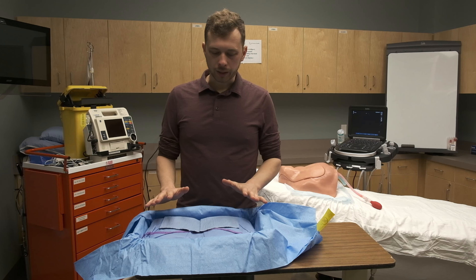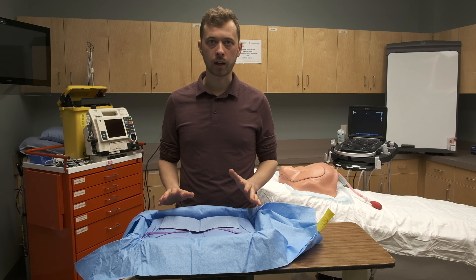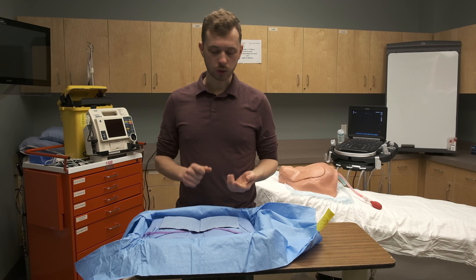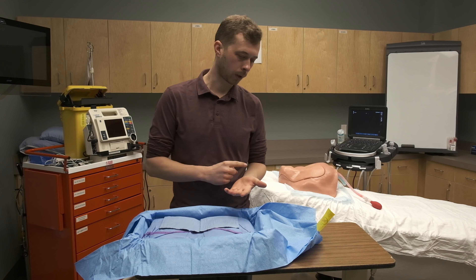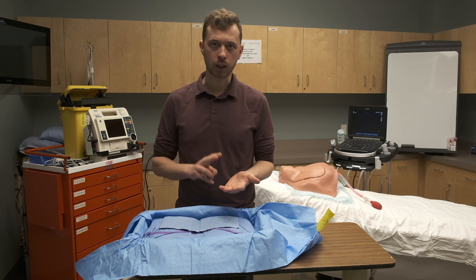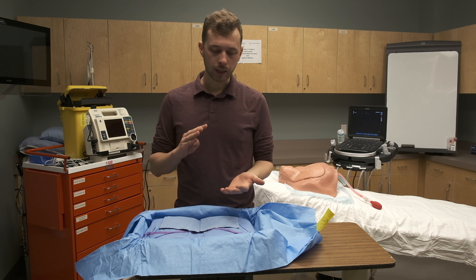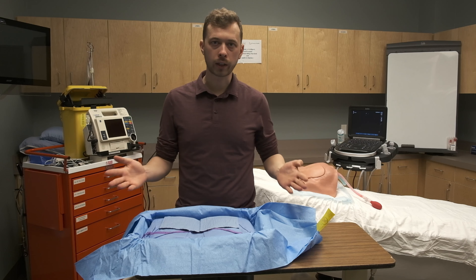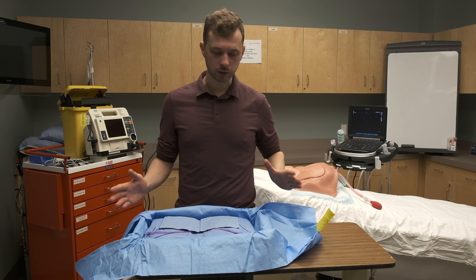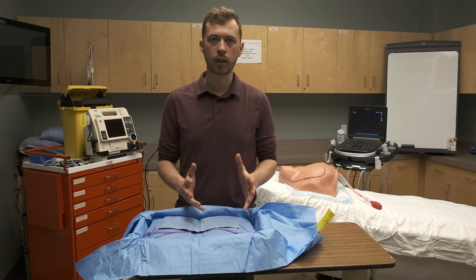The Seldinger technique is really common and it's a really important skill to learn if you are in a specialty that requires procedural skills. It's used for things like central venous access, which is what we're going to be showing you today, but it's also used for percutaneous intervention in acute myocardial infarctions. It's used for endovascular therapy in stroke. It's used to access virtually any hollow organ, including the pleura for things like chest tubes. It's just a wonderful way of ensuring safe access to whatever you're trying to do.